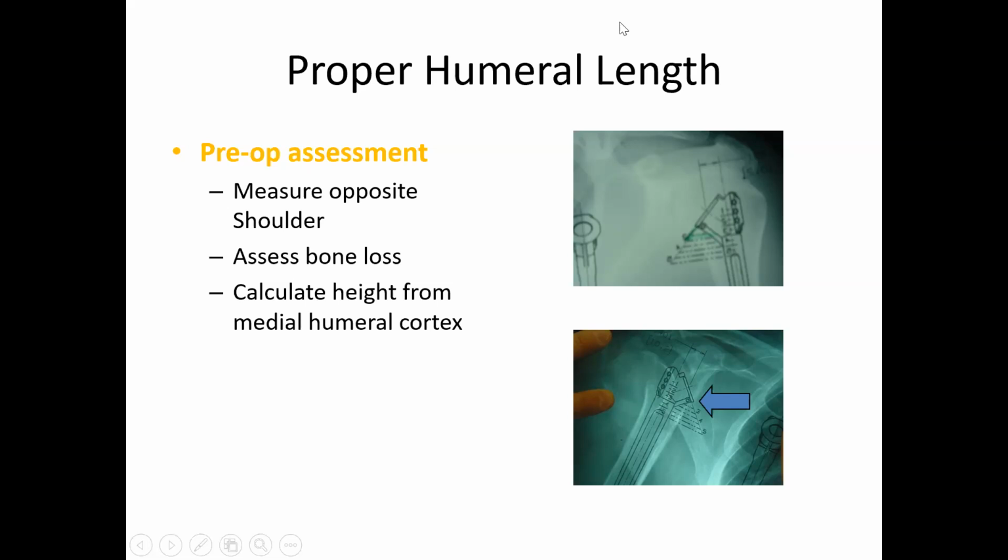And then once I identify the long head of the biceps, I open the groove and the interval, as you can see, until I reach upwards. And then I deconstruct the fracture. So I put an elevator, whatever you would like to put in inside the fracture site, just dislodge the fragments. And then after separation and isolation of the tuberosity.